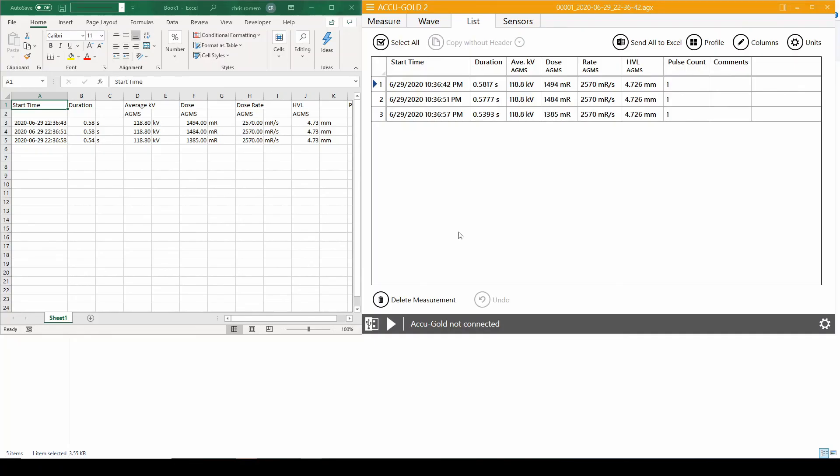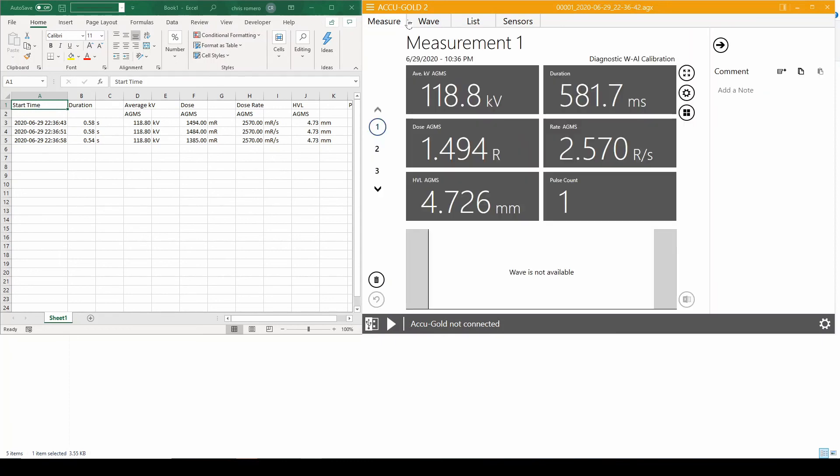As you can see, all the data values, including the headers, were automatically transferred. If exporting all the data is not required, you can manually click and drag individual values from the measure tab to any cell of choice.